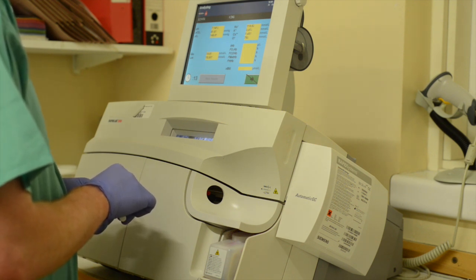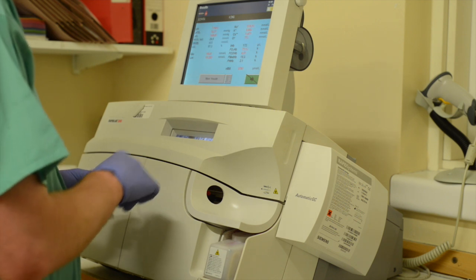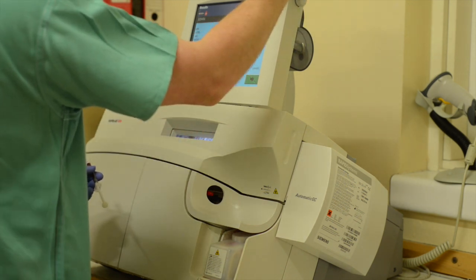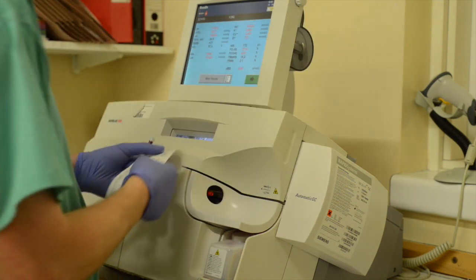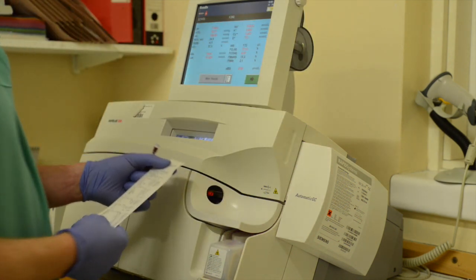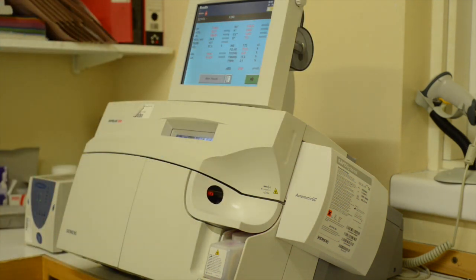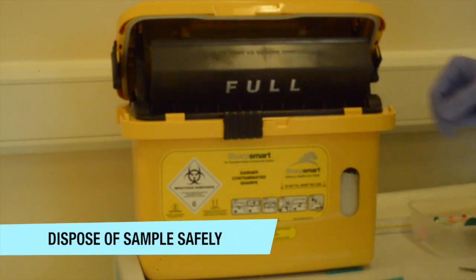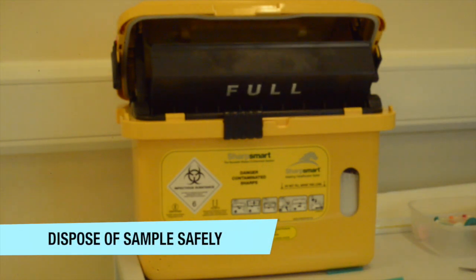The parameters provided by the ABG machine are often provided on a paper printout, which can then be interpreted using the rules and guidance supplied in this textbook. Again, ensure that you dispose of your sample safely at the end of this procedure.